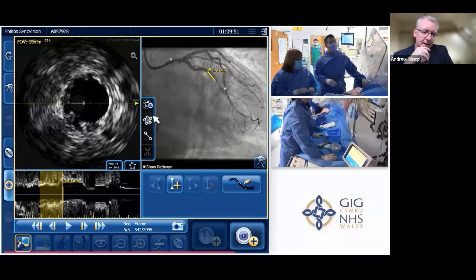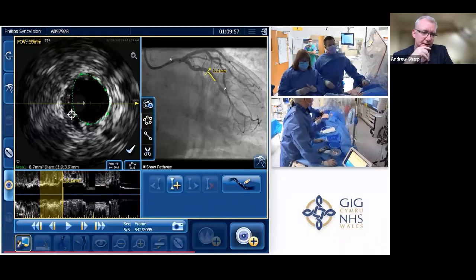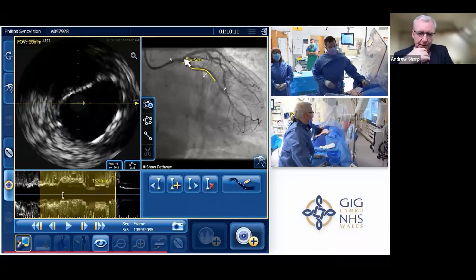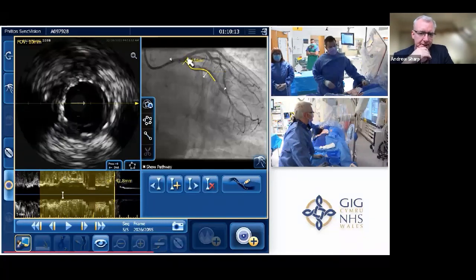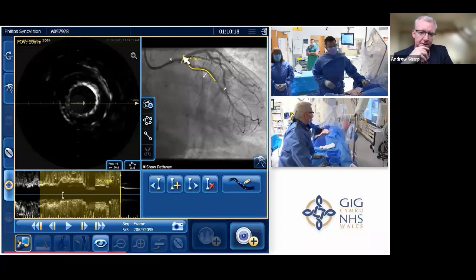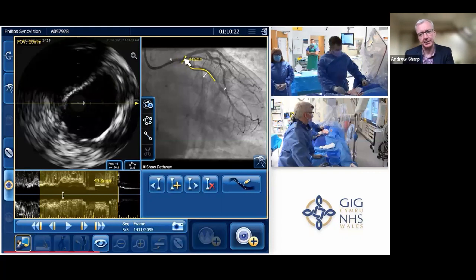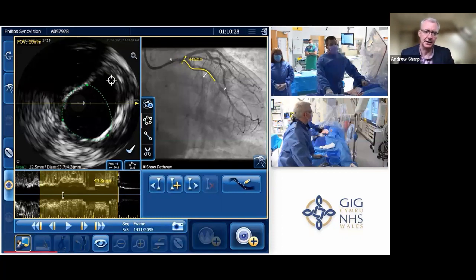And I'm now about to measure the stent result and see how big it is. And it's a little on the small side. We wanted 3.5 diameter at that point, and it was more like 2.7. We scroll back to the ostium of circ, and we're slightly worried, will it have expanded properly? And in fact, it's done it nicely. There's a guide catheter in there. And that's sometimes what happens with the Eagle Eye. As we pull it back, sometimes it pulls the guide in. So it just needs counter traction on the guide. But we're now at the ostium of circumflex.